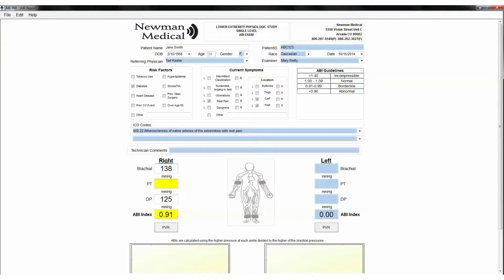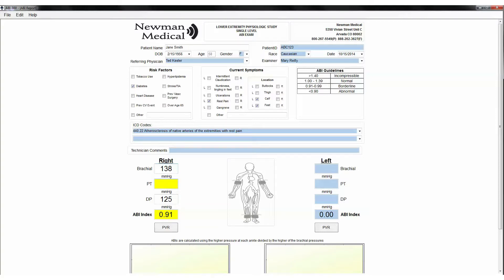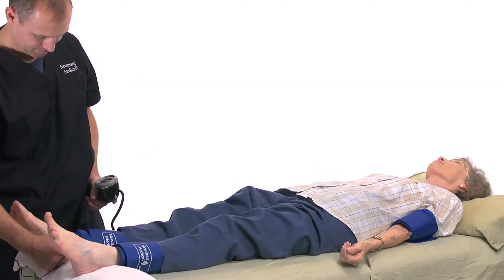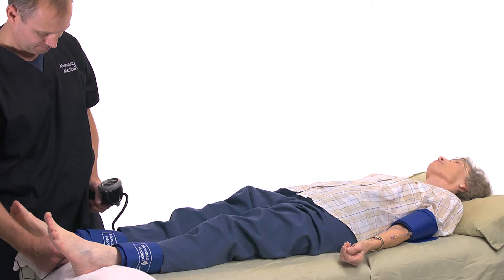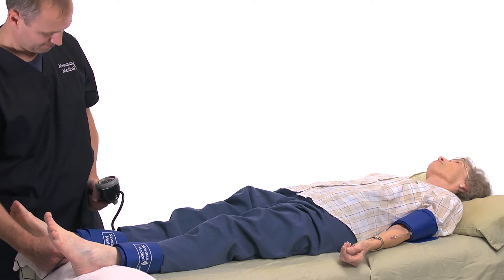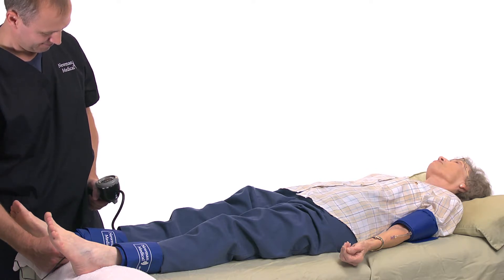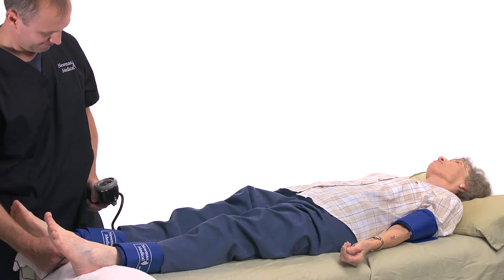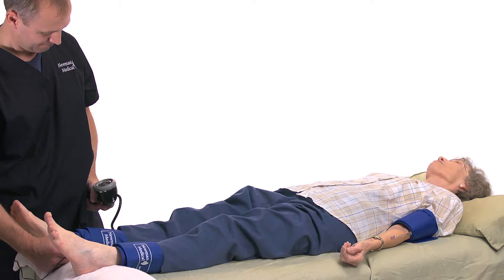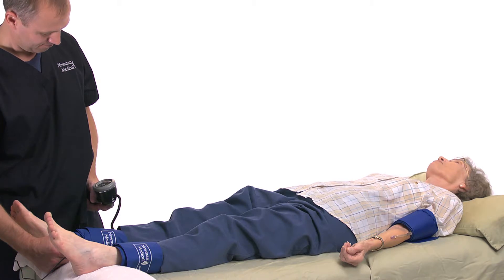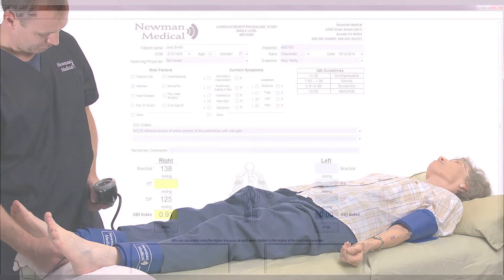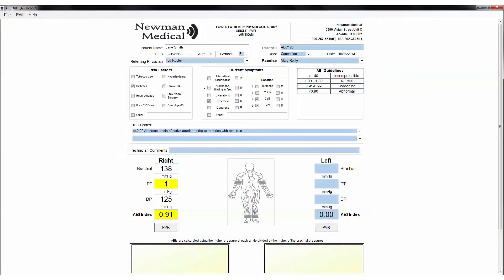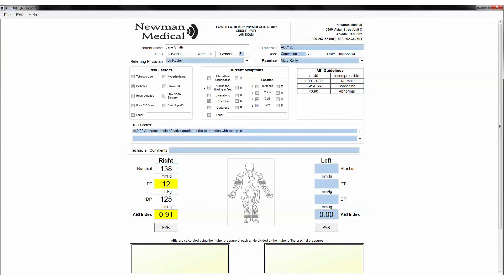If satisfied, use the cursor to select the PT field or press tab. Place the Doppler probe on the PT artery behind the inside ankle bone. Obtain the pressure by the same method used on other sites. When you hear the Doppler signal return, note the pressure on the gauge and enter it in the PT field.